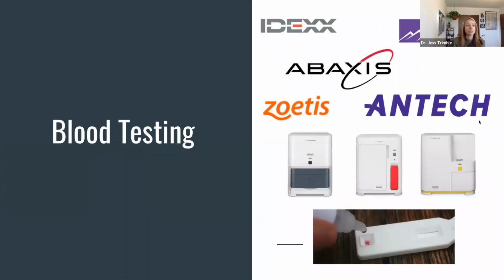If we move on to the next one, blood testing. So as Robert said earlier, benchtop analyzers, they've been around for years. This is nothing new, but this is considered a point of care diagnostic, right? If I send lab work off, it's going to take usually 24 hours at minimum, sometimes a couple of weeks to get a test back. These benchtop analyzers significantly decrease that time.